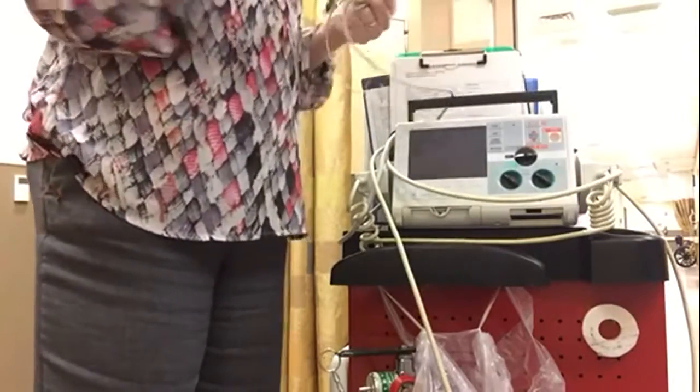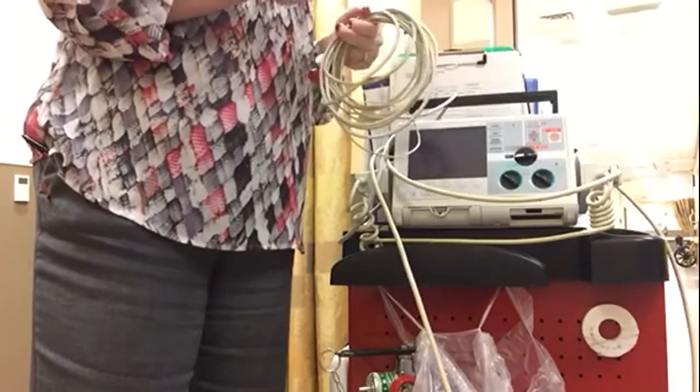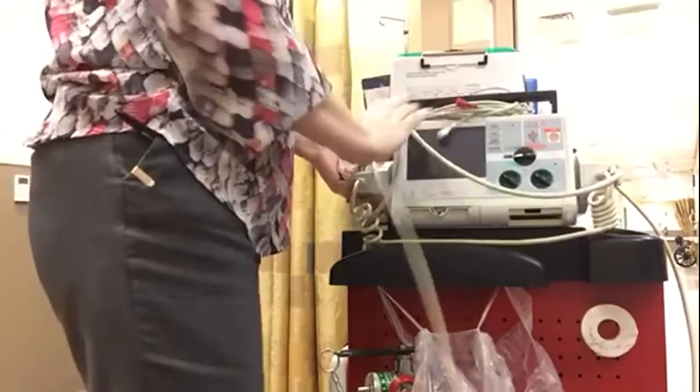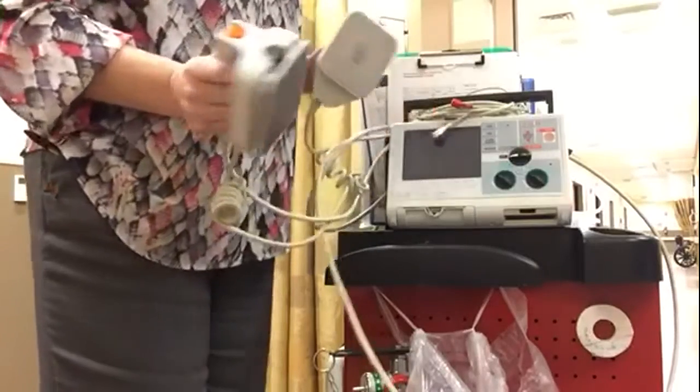You need to have the monitor on if you're going to do pacing or defibrillating. The patient should also be on this monitor. The pads are on the side.